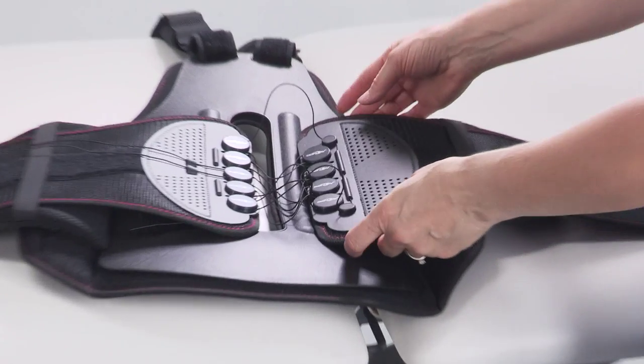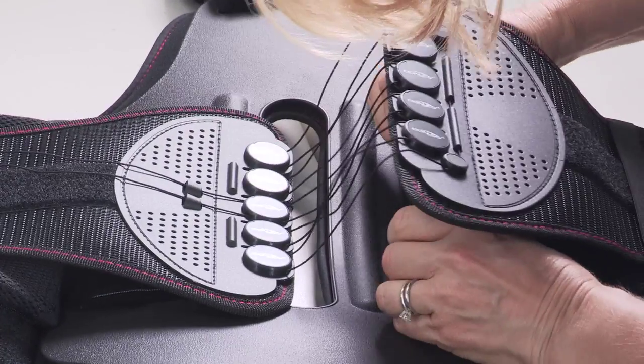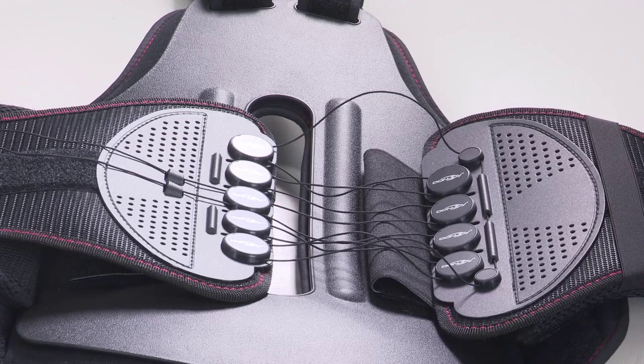If needed, to modify the waist belt, adjust the side panels by unhooking the Velcro on the back panel and moving panels more centre for a smaller waist, or closer to the edge of the back panel for a larger waist.